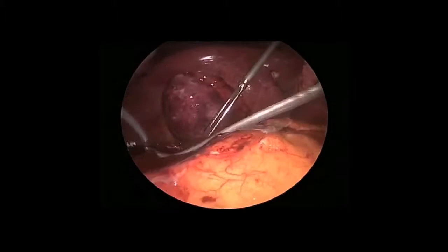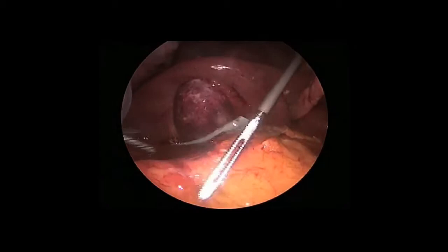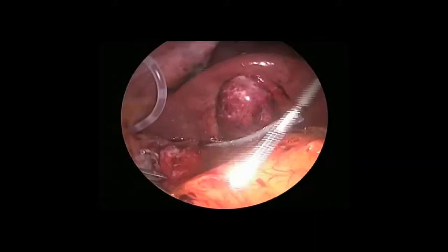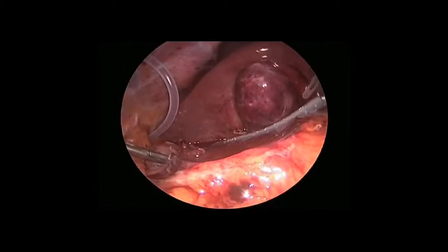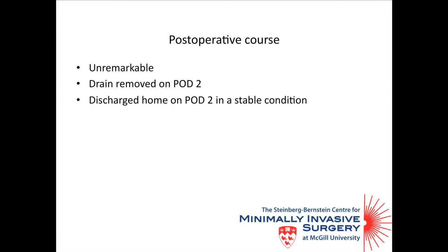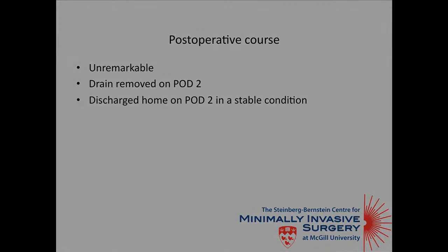The end of the case presented another dilemma in our clinical decision making: should we leave a drain? Seeing as though there was a significant inflammatory reaction, we opted to leave a Jackson-Pratt drain. However, was it necessary? The drain was placed adjacent to the site where the foreign body was removed and sutured to the abdominal wall.